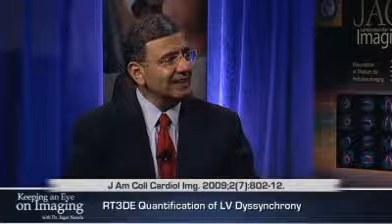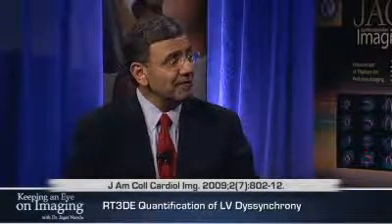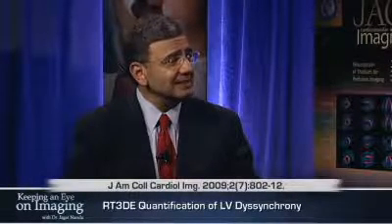Victor, you just had published in JACC Imaging a study on the role of 3D in evaluating dyssynchrony. It had some interesting findings. Tell us a little bit about the study. In this study, we studied two groups of patients, patients with normal left ventricular function and patients with a dilated cardiomyopathy. Each of these groups had two subgroups with and without a left bundle branch block.